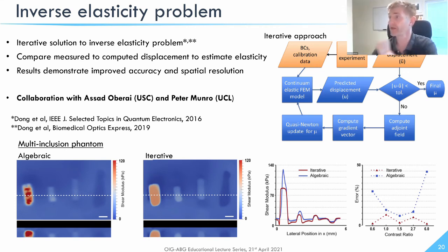The nonlinearity can affect us. Depending on how much you push the probe, you definitely can stiffen the tissue, as it were. But we've seen that over the range of deformation applied by the surgeons, it's fairly consistent. We believe that's because breast tissue is fairly linear in the deformation range of around 0 to 20% strain, so it hasn't affected us too much.